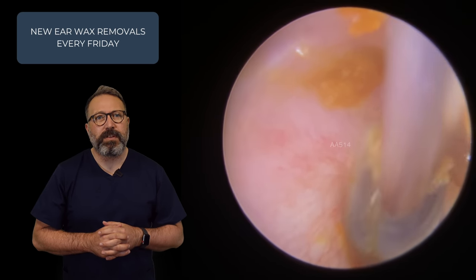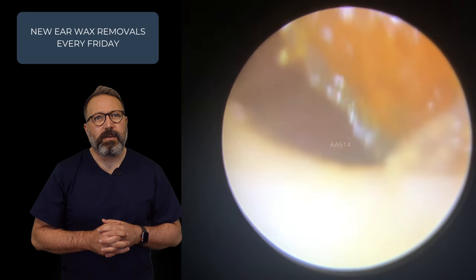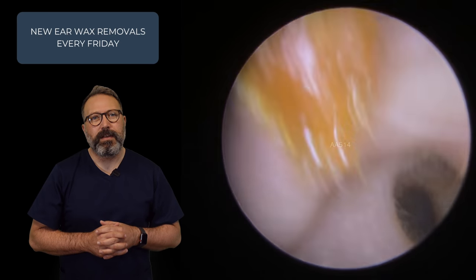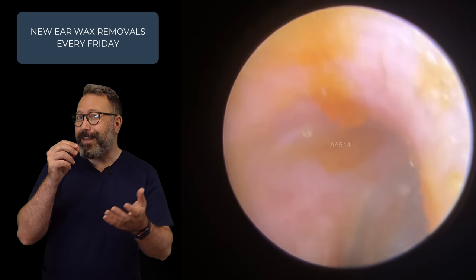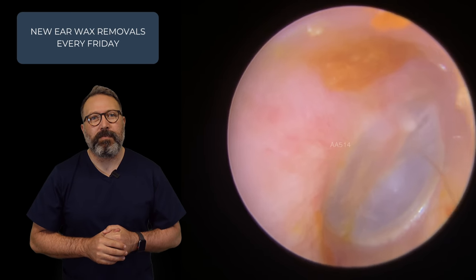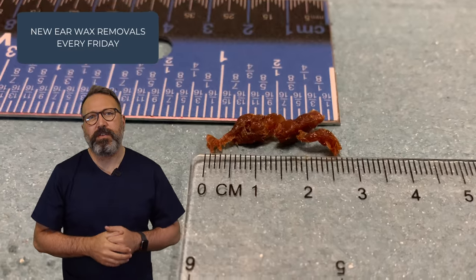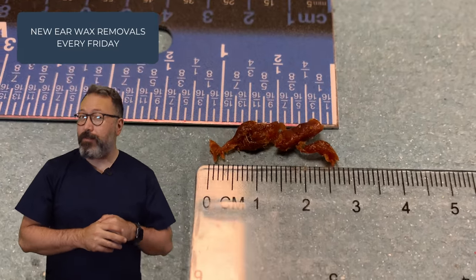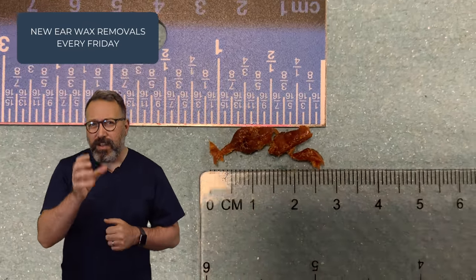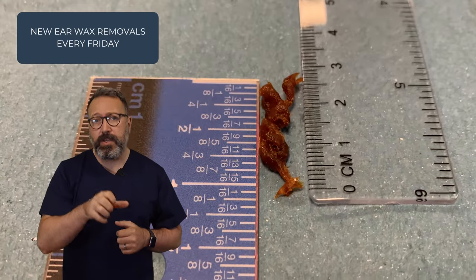There we are — pulling down from the top and off that comes. I did remember to hold it and show you. You can see that eardrum in a bit greater detail there. So this is what we removed: two and a half centimeters, just over an inch and one sixteenth, out of that ear canal. Some really, really big old chunky bits of wax — you can see why this patient would have been really struggling on that one side. It's not uncommon to get wax just affecting one side; sometimes there's an anatomical reason, but a lot of the time it's just a bit of luck.